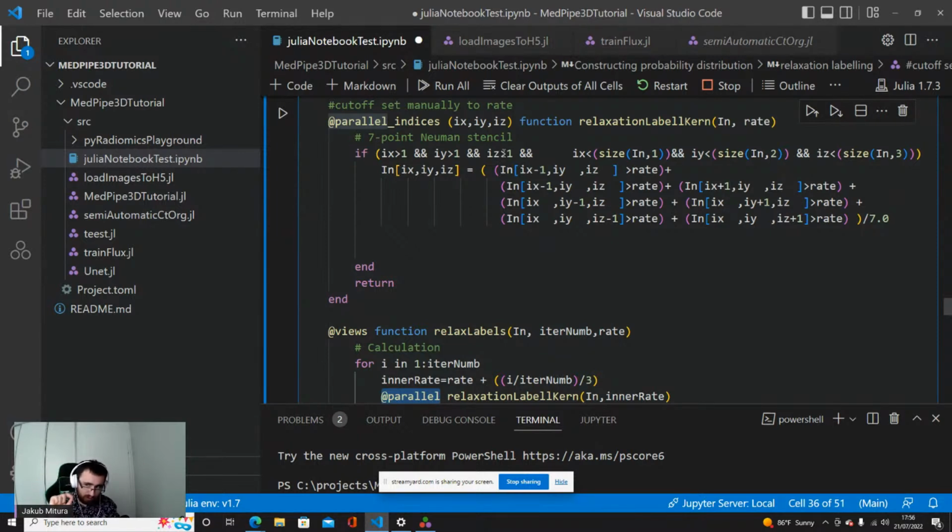So one more time, you are getting a single point, and we are looking at the neighborhood. If there is a high probability that this is the liver or this is the spleen in the neighborhood, we are changing this point to being a liver. And the other way around is also working.